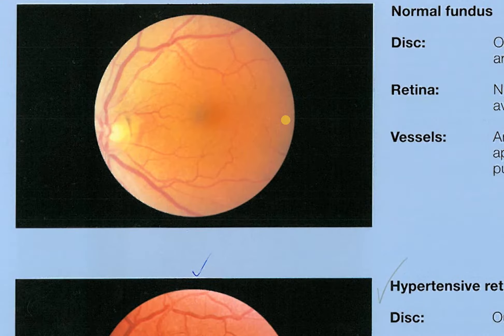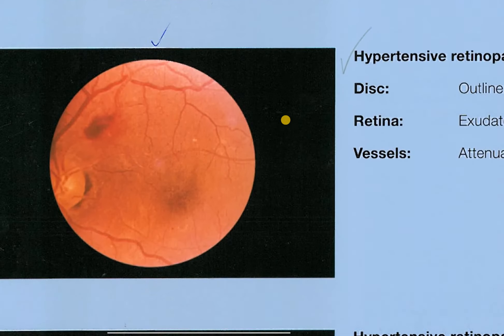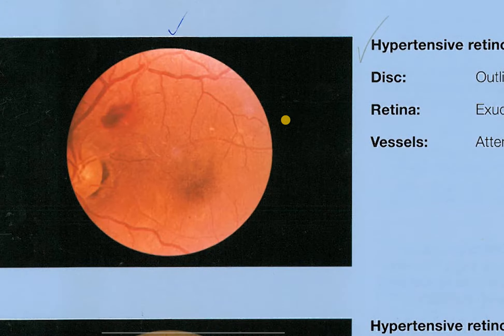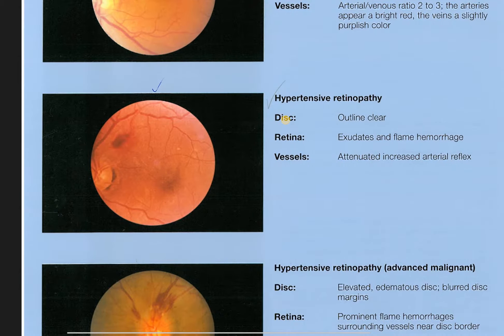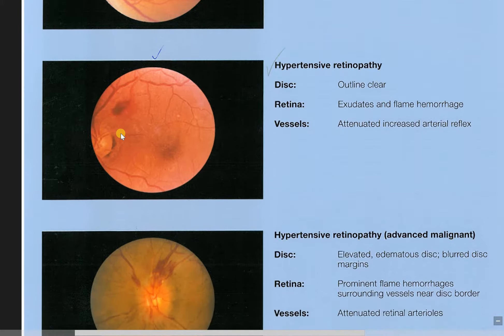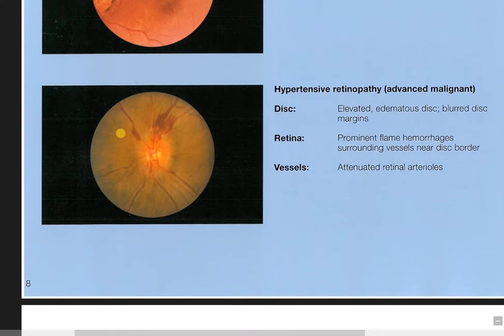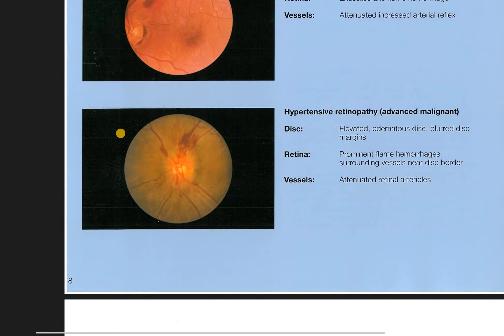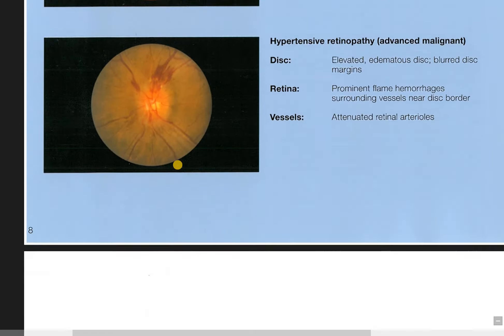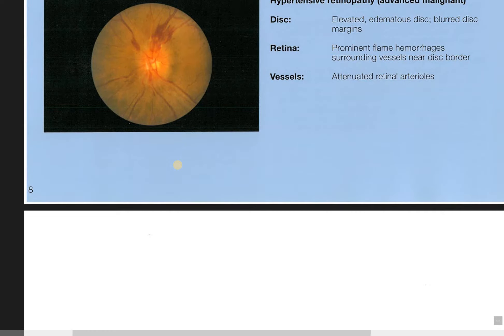There's your normal — now let's look at some abnormals. This one doesn't look right; this happens to be hypertensive retinopathy. There's pressure, there's a blood vessel that's not happy right here — it's a hemorrhage. Here's malignant hypertensive retinopathy. You can see the damage to the blood vessels, the color looks off, the disc doesn't look right, and the macula is just obliterated — it's not really there.